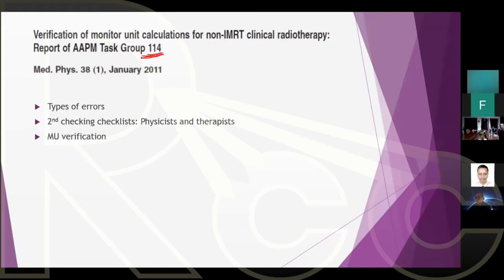Masoud is saying 2%, and 02210 is saying less than 5%. Okay, so again, you can see that someone is accepting 2% and someone else is accepting 5% or less. And it really depends on your clinic. However, it's good to base it upon some sort of publication. Thank you. No, it depends on the case at hand. That's good. So let's say it depends on the case at hand. What is the most disagreement you would go with? Okay, I was expecting someone to write something.